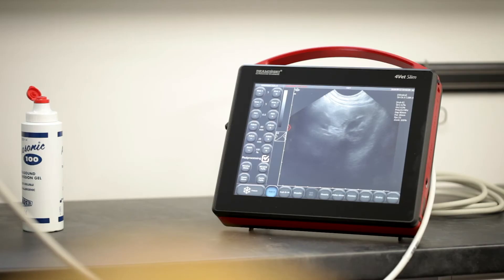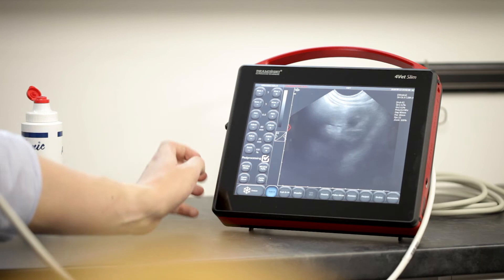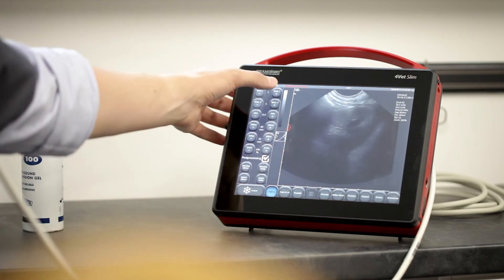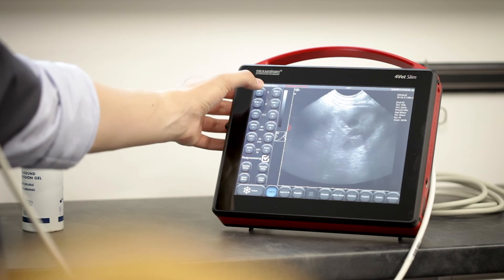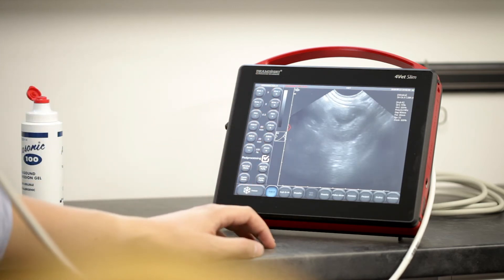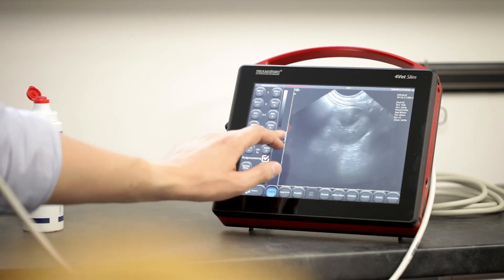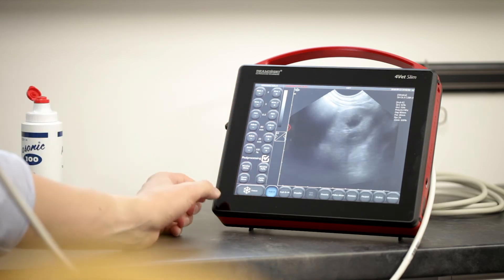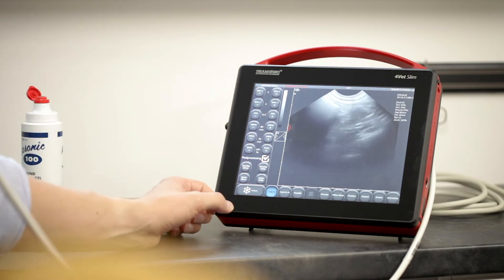This is the cross section. If we would like to change the gray map — make the image a little bit softer — we can use the gamma setting, and now the image is a little bit more grayish. If we would like to add some contrast as well, we can do the same with the gamma setting and then increase or decrease the gains.